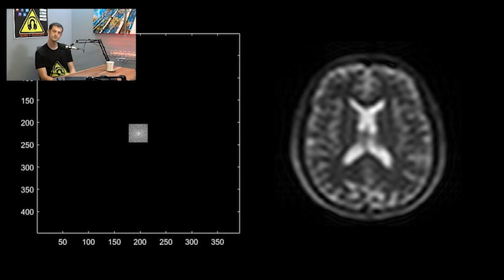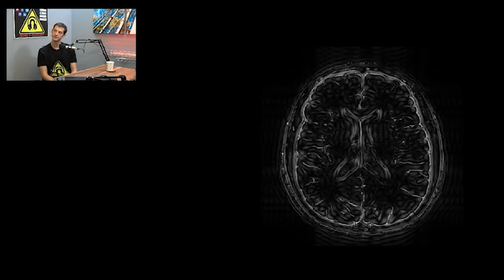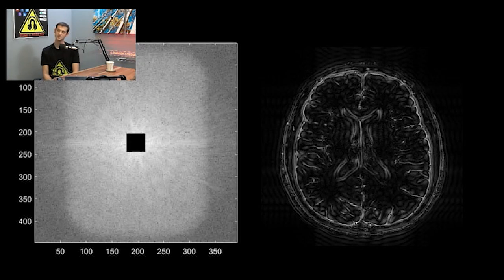All right, so next one. And this is just the edges. So what do you think? What Kspace is going on here? Well, center's missing probably. Exactly. Yeah, it's a donut. So it's the opposite. I threw out the center. Now we lost the contrast information. We lost the sort of general look, but you do see the edges. And yeah, that's what you get.